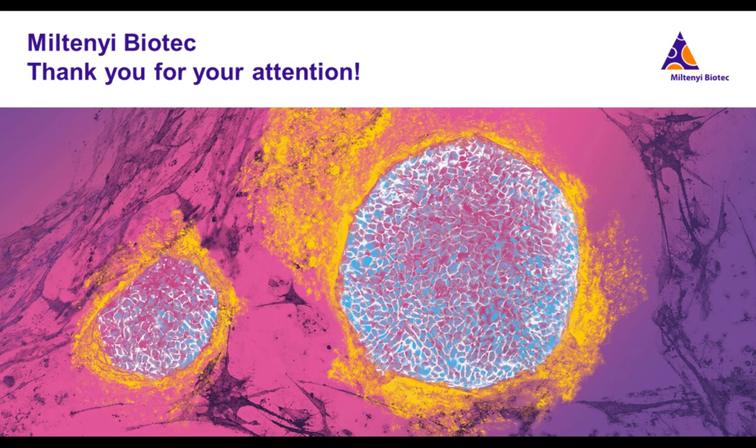Is it possible to utilize cocktails of antibodies in a single staining and imaging cycle? Yes, this is actually what we are doing, because we are staining up to 3 markers per cycle. And in the future, as I said, this will be increasing. So therefore, yes, you can do that.